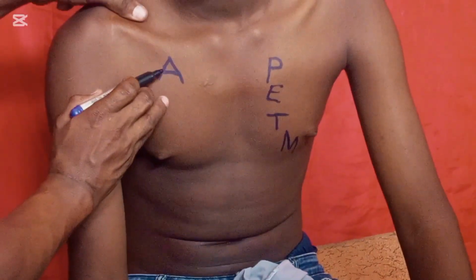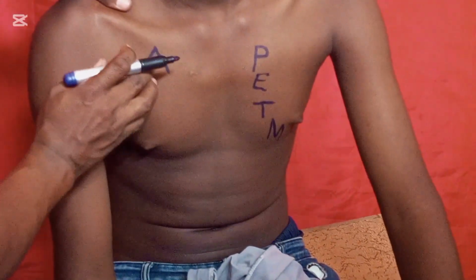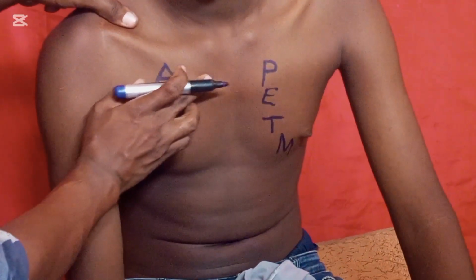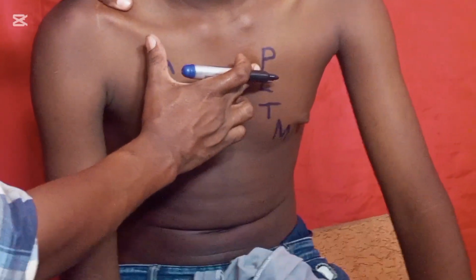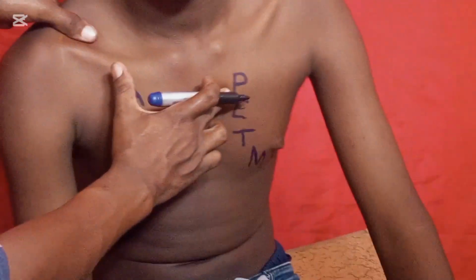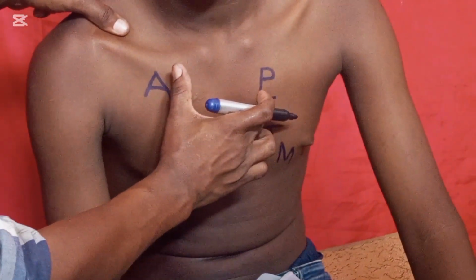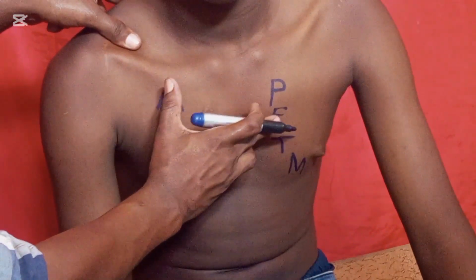So we have said here is the second intercostal space on the right side of the sternum. We have the aortic valve. Then we move directly into the second intercostal space on the left side of the sternum. So we find here the pulmonic valve. And we move into the third intercostal space. So that is the Erb's point.